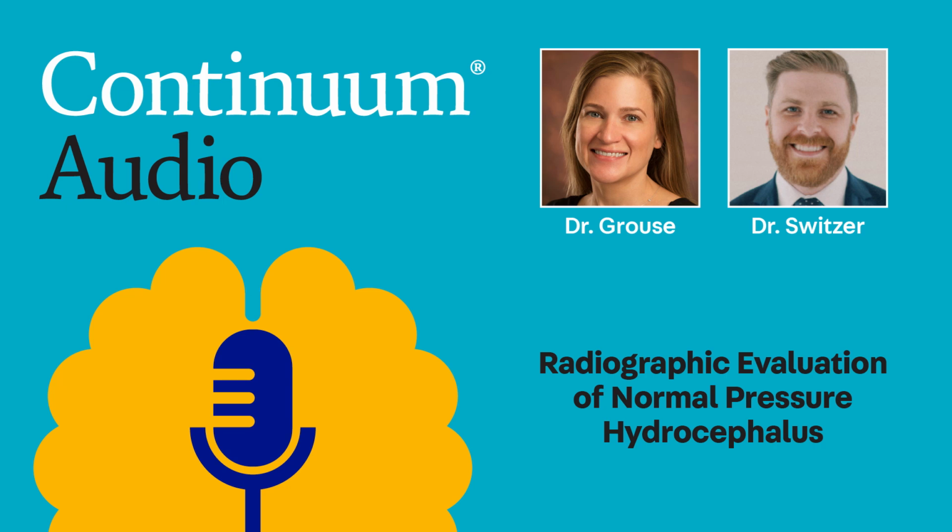I think the first thing to acknowledge is that predicting shunt response is still a big problem that is not fully solved in NPH. So there is not one single imaging feature or even combination of imaging features that can reliably predict shunt response. But in my view and in my practice, identifying DESH, the disproportionately enlarged subarachnoid space hydrocephalus, is really important, as well as measuring the posterior callosal angle. I find those two features to be the most specific.